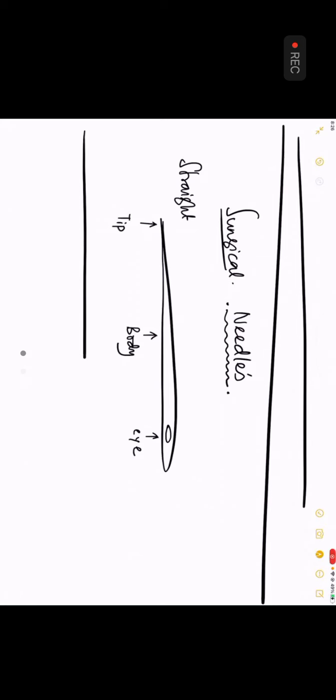Now, this type of needle is used for skin suturing. You must have seen some senior gynecologists use them for skin suturing. If you talk to tailors, or maybe you can ask your mother at home today to show you the sewing kit, probably the needle that comes out of the stitching box is this one. So this is this needle. That is something that you have seen.